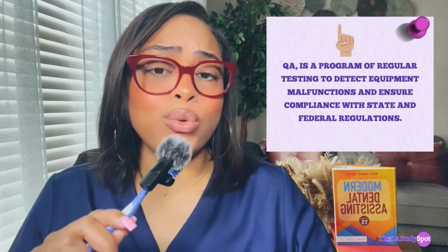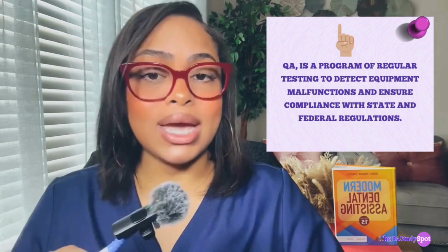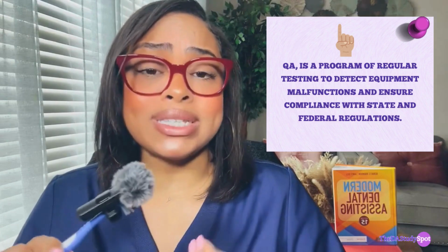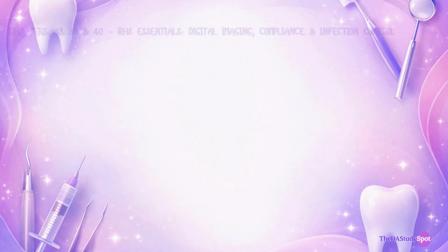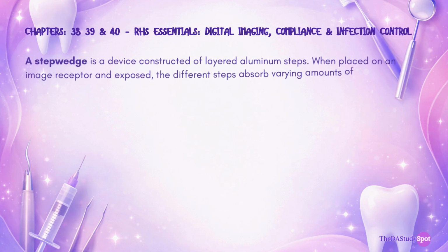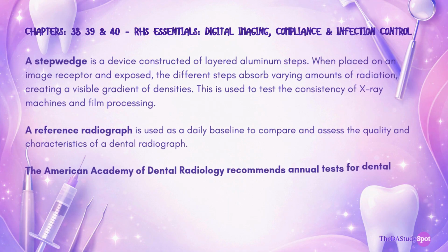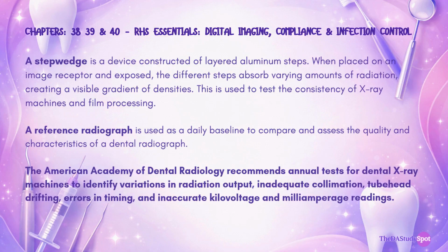Quality assurance, or QA, is a program of regular testing. It is to detect equipment malfunctions and ensure compliance with state and federal regulations. A stepwedge is a device constructed of layered aluminum steps. When placed on an image receptor and exposed, the different steps absorb varying amounts of radiation, creating a visible gradient of densities. This is used to test the consistency of X-ray machines and film processing.